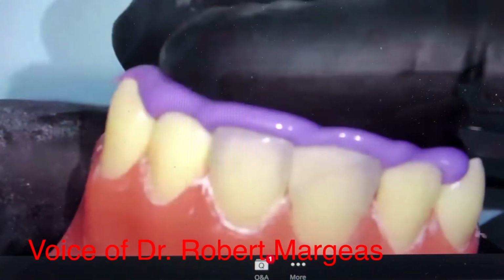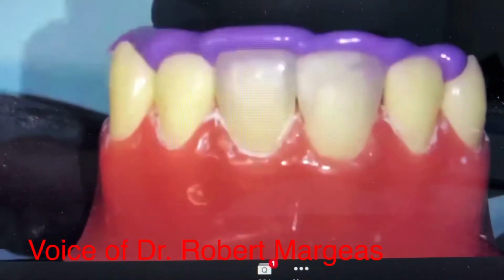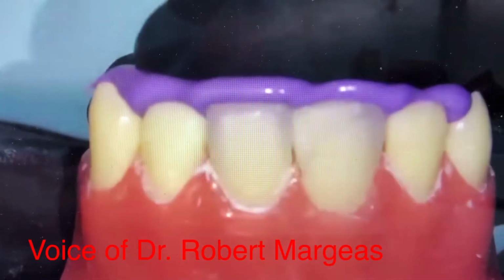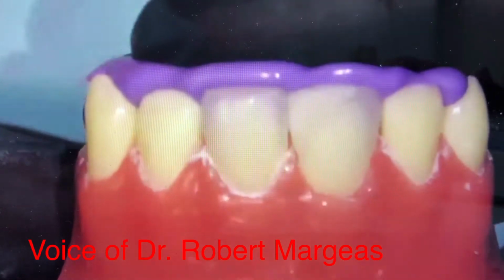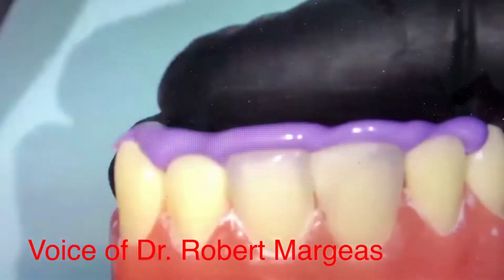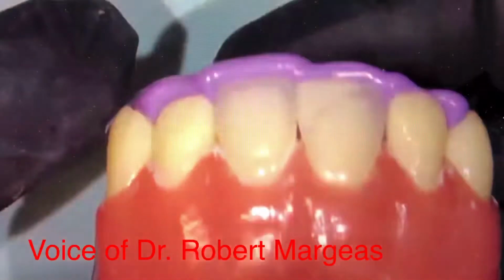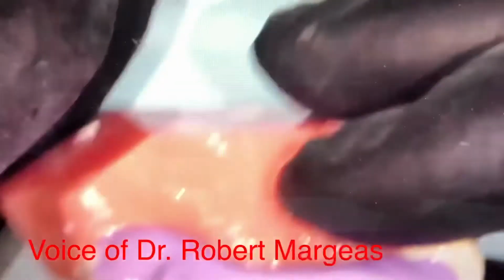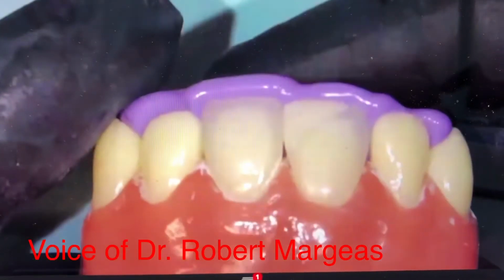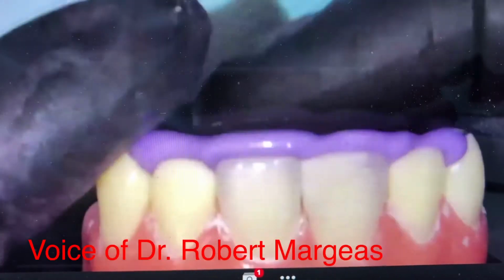And then I'm going to break that piece off. Once that sets in the mouth, I would say it takes about 30 seconds to set. Here it may take a little bit longer because it's out of the mouth, but I can see that it's starting to set. This is a very unique material, because it was meant to be used, as it stated, as a temporary matrix material versus, let's say, a blue mousse or material like that.